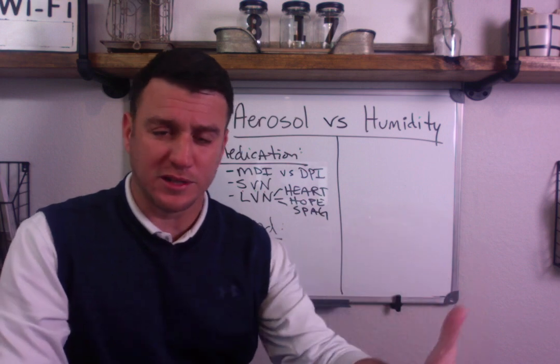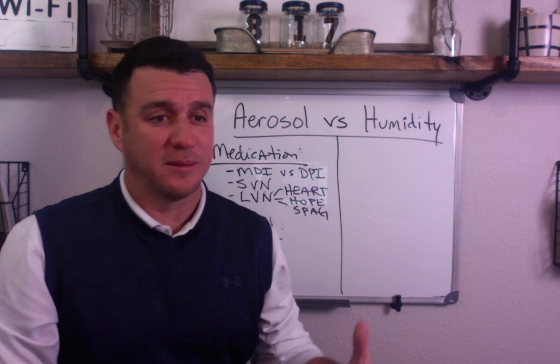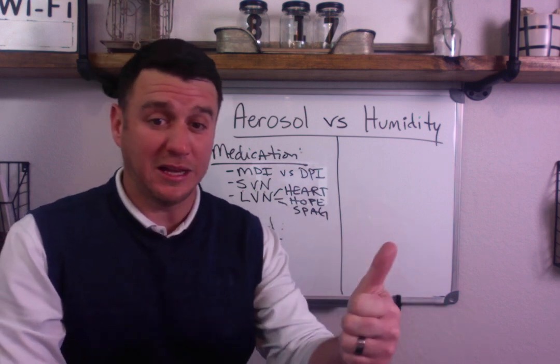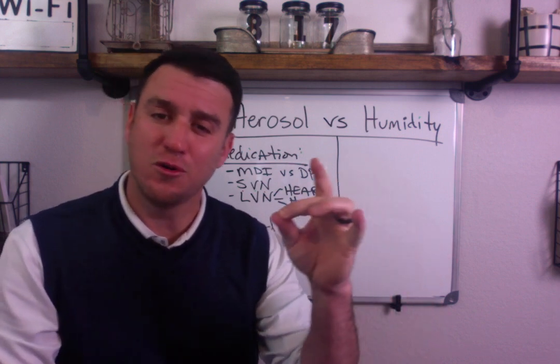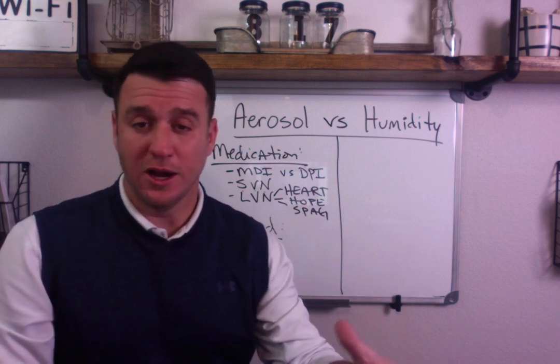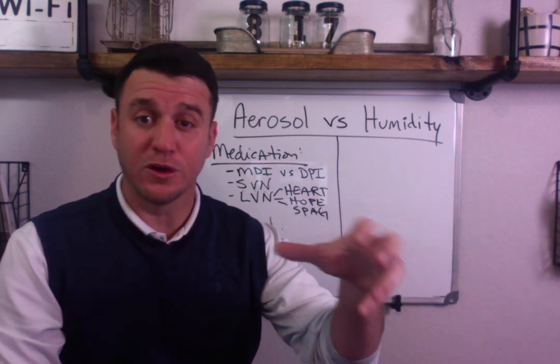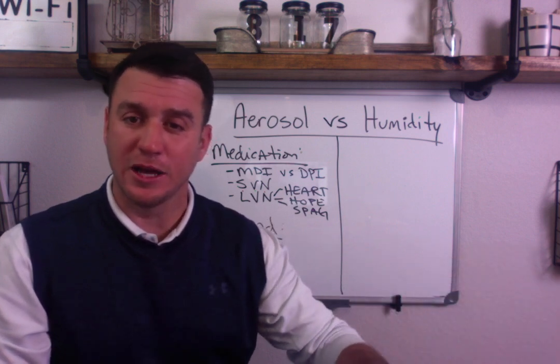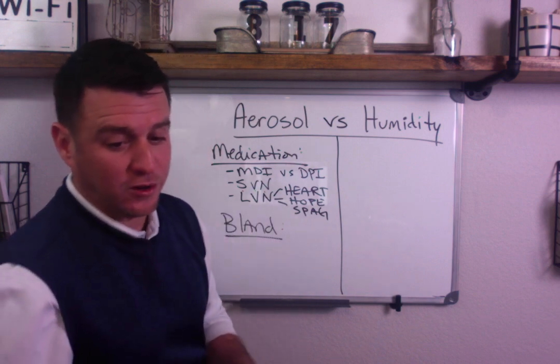So if you're taking your board exams or you're taking a test and it says, hey, you wish to continually nebulize 10 milligrams of albuterol, which device would be best suited to do so? MDI, SVN, Heart nebulizer, or Spag, then you're going to go with the Heart nebulizer. Okay, so that's kind of where that goes there. You could substitute Hope in for Heart. Those are designed to deliver medications over an extended period of time beyond just back-to-back therapies. Okay, so that's the LVN there, or the large volume nebulizer.